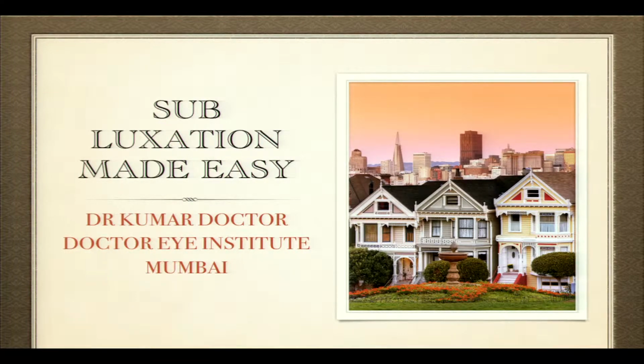Well, I'm going to talk on phacoemulsification in subluxated cases. I spoke on the same topic in Hall A, but that was different levels of subluxation. Right now what I'm going to show is advanced subluxation and then what to do. So not where there is no donesis, but here when there is donesis. So there are different situations. Here I'm going to show you the use of femto laser as mentioned by Gaurav.